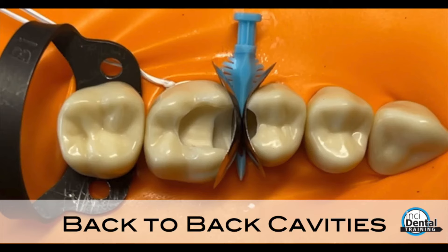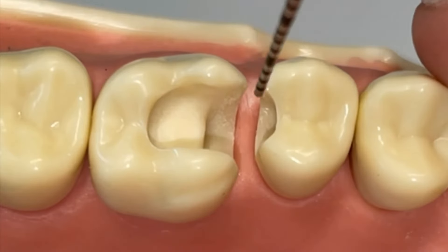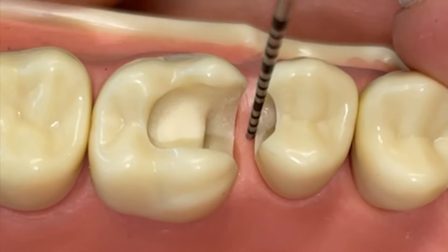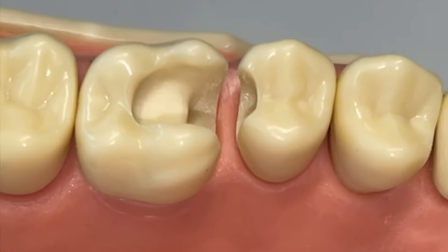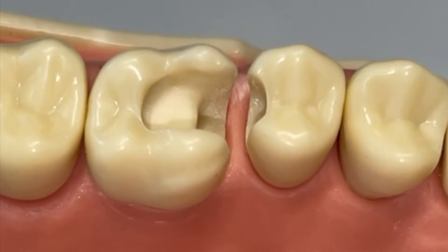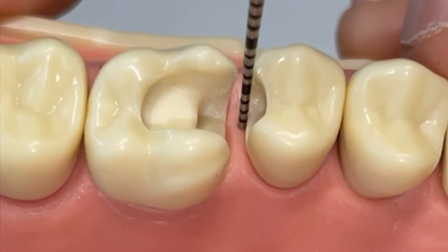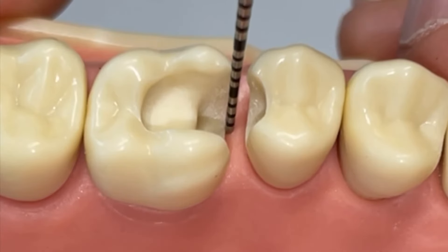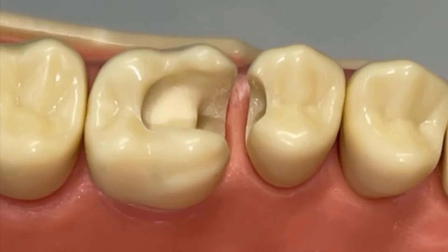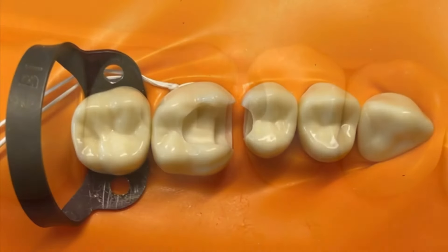In this tutorial we're going to look at back-to-back cavities, which can be quite a difficult matricing situation where you've got two cavities facing each other. Just before we isolate with the rubber dam, we're going to check that we'll be able to put a wedge in where we need, and also have a look at which of the cavities is higher relative to the gingival tissue. The premolar cavity is much higher from the gingiva than the molar, and that's worth knowing. You can also check whether you can get a wedge under them, because you could do a partial papillectomy at this point.